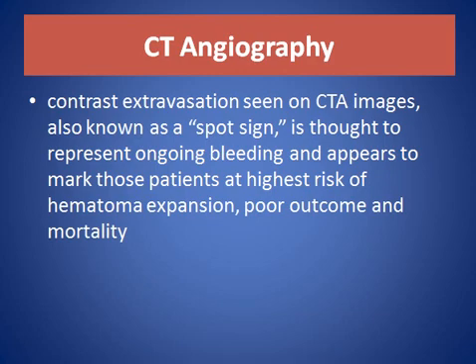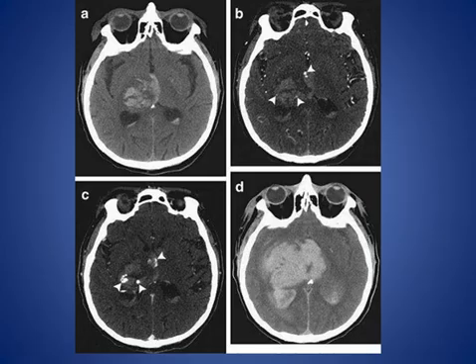Contrast extravasation seen on CT angiography images is known as the spot sign. It is thought to represent ongoing bleeding and marks those patients at highest risk of hematoma expansion, poor outcome, and mortality.